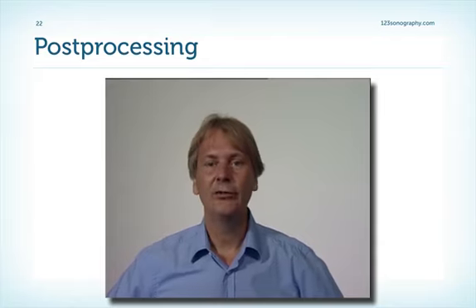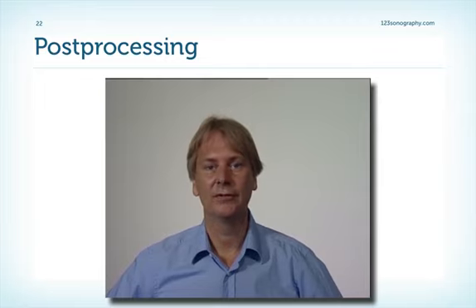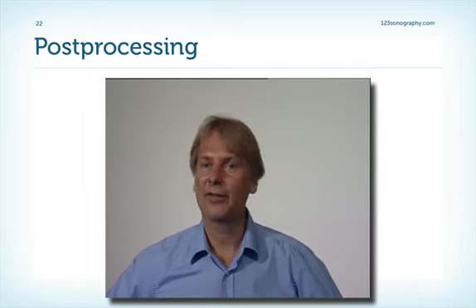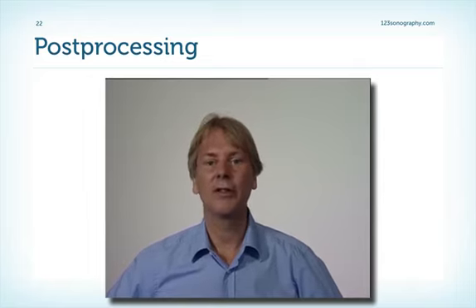Imagine you're on vacation and you take a photo which is very important to you. But unfortunately, the lighting situation is not very good. What do you do? Well, you take this photo to your computer and you play around with it with special image processing software, and then you end up with a photo which looks much better than the original photo. Basically, this is exactly what post-processing is. It's taking the information we have and trying to change and manipulate it in such a way that it appears better to the eye. In echocardiography, the objective is to enhance our ability to interpret structures and to make a diagnosis.